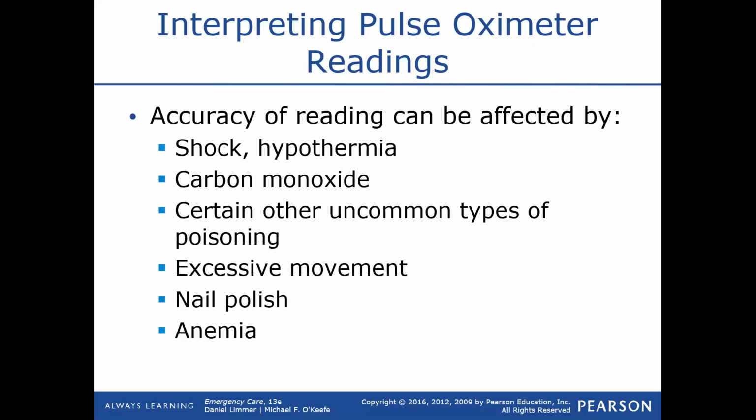So you could be suffocating on the inside because the oxygen molecules can't attach to the blood. A pulse oximeter reading is going to say 100%, but a lot of that could be carbon monoxide. That could be very serious. So we need to understand carbon monoxide poisoning and what those signs and symptoms are, which of course we'll get into in a later section.